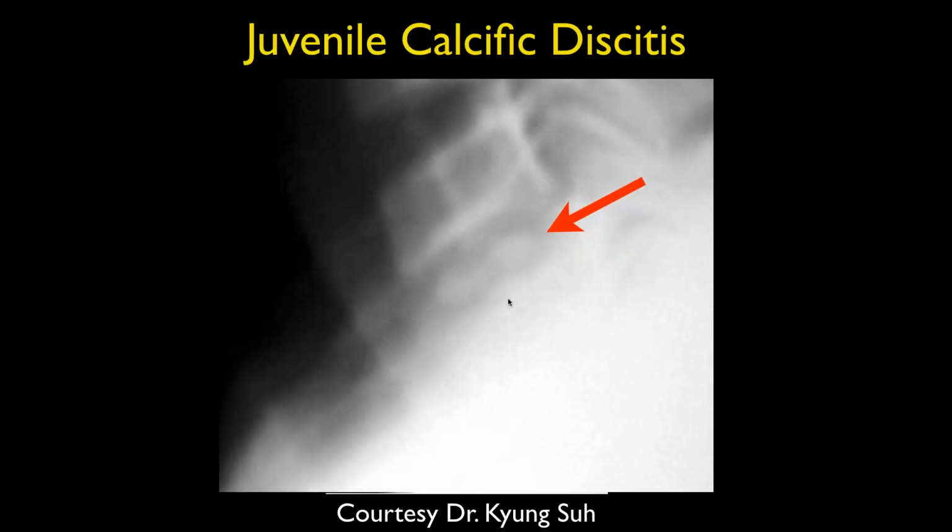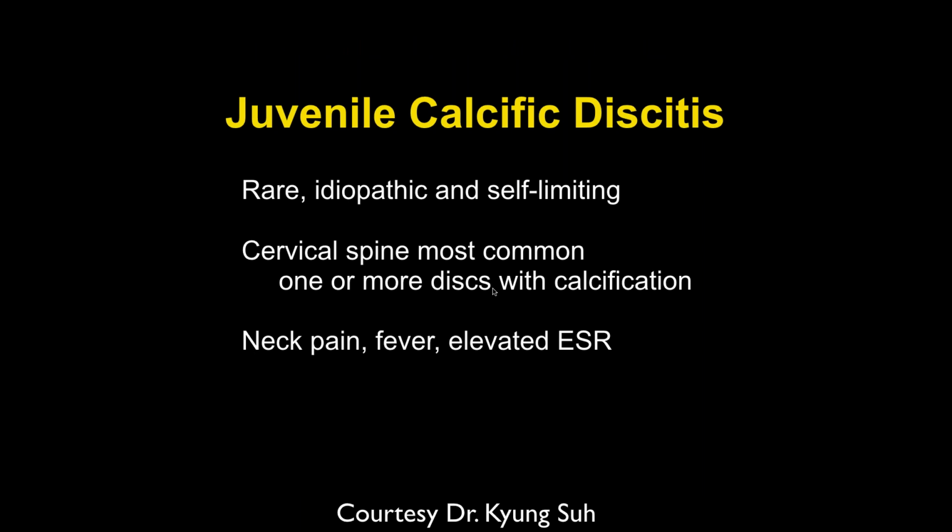Okay, but this is a kid, and there's a known phenomenon that's not common called juvenile calcific discitis, which presumably is some sort of trauma, since kids have very flexible necks. Trauma to the disc, which then causes dystrophic calcification in the disc itself. I would think of infection.